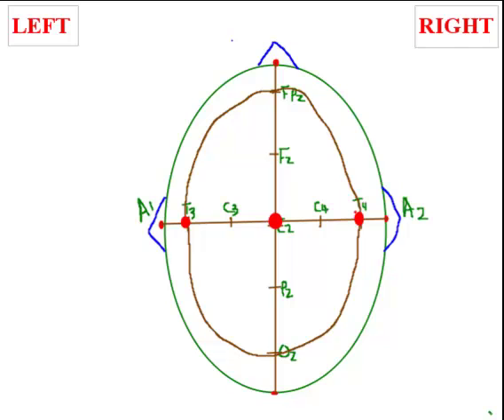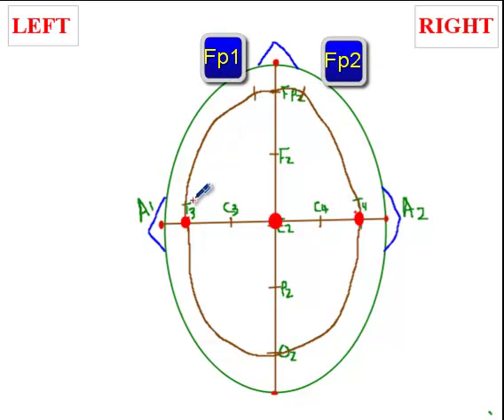You have to do some more measurements now. The next step is, after you've calculated this circumference, you measure 5% of the circumference from the midpoint of FPZ, put a mark here.